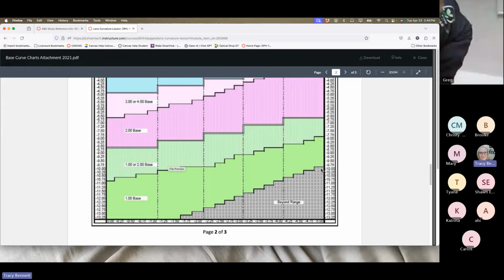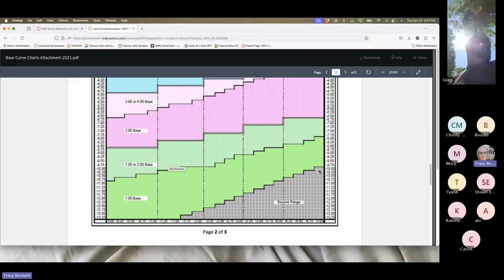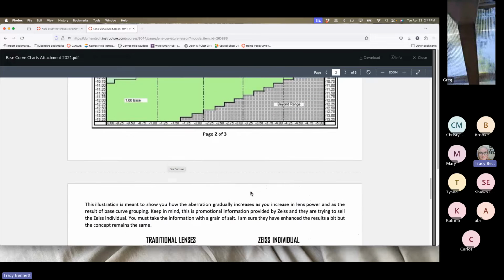So yeah, if it just so happened to be a 10 diopter sphere with a 5 diopter cyl, that's just too much for this lens to handle. If you look at the two power meridians, we've got a -10 and a -15, and that -15 is just too much. So the higher the cyl goes, the less you get to use this lens. You probably need to change to a different material, probably, believe it or not, plastic.